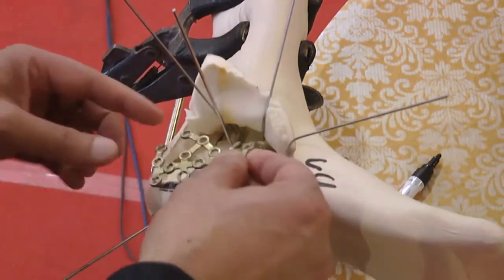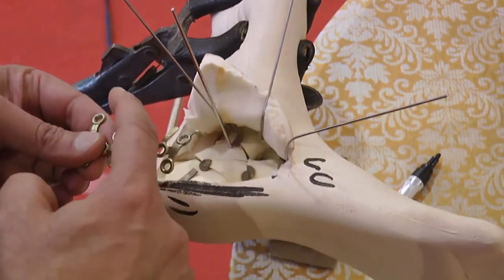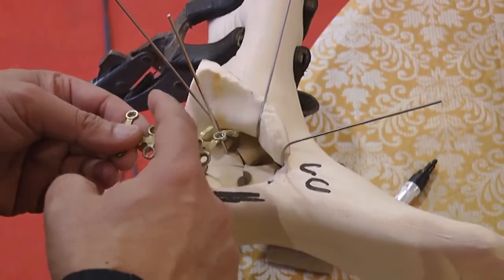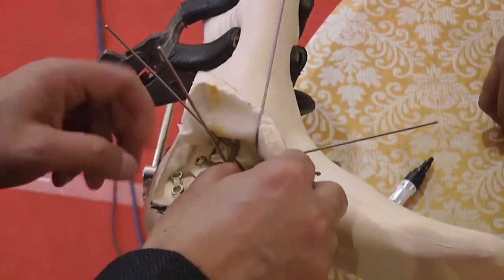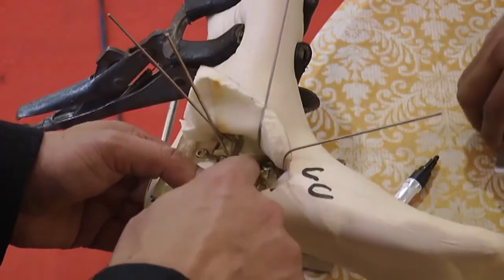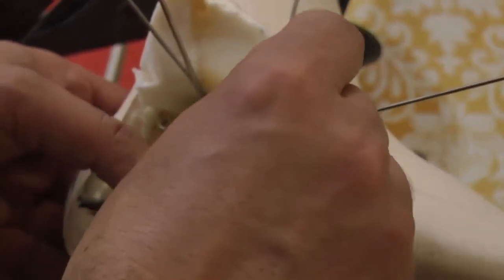So this plate is malleable. The anterior part of the plate is meant for the cuboid, and this angled arch is meant for sustentacular screws below the thalamic screws, holding the lateral facet to the medial calcaneal, medial sustentacular fragments. So we have a locking sleeve. Once you put that plate, you'll see how malleable that is.